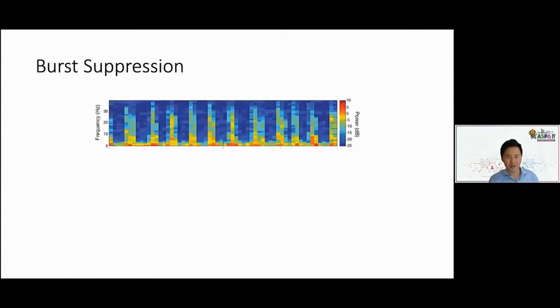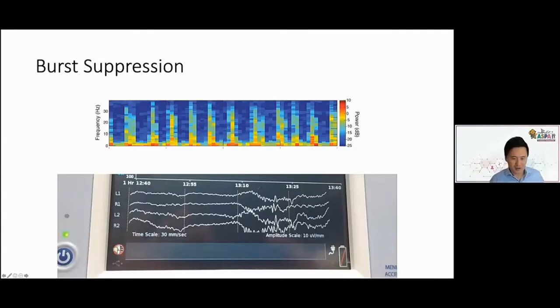And here's another thing, burst suppression. So we saw here in the waveform these periods of very small EEG alternating with periods of larger EEG, which recapitulate that slow and alpha oscillation that would have been present. So in the spectrogram, we see periods of blue that correspond to the very small EEG. Small is like a low power, low signal. So that's blue, mapping onto blue here.